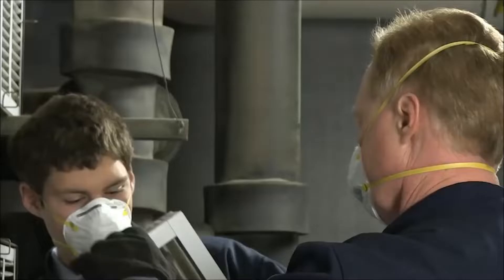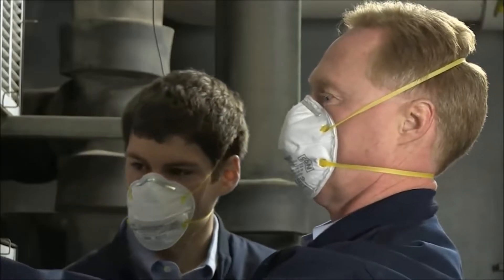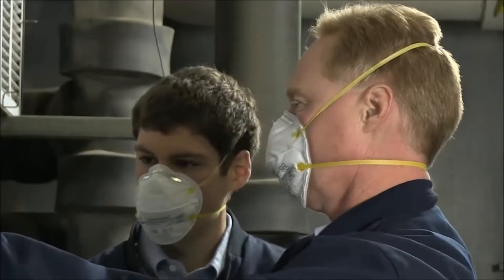If you wear a respirator on the job, it's important to know how to safely put it on and dispose of it when you're finished with your work.